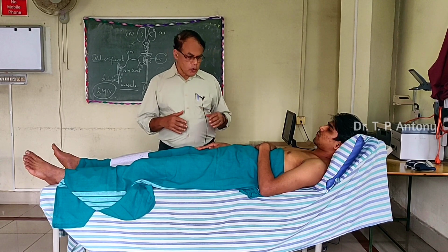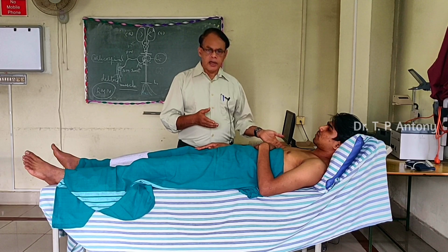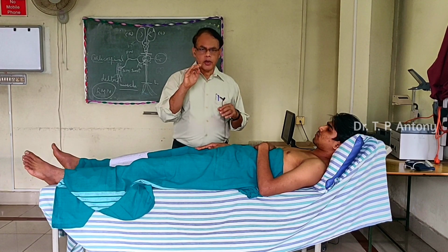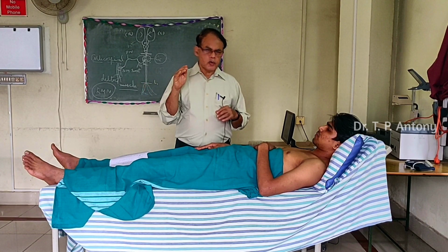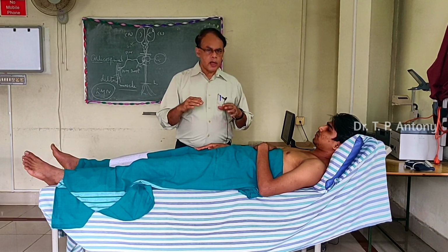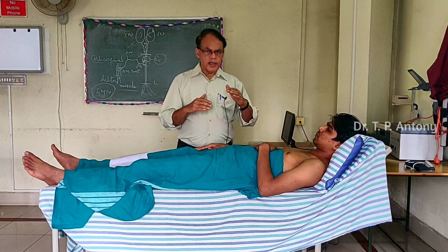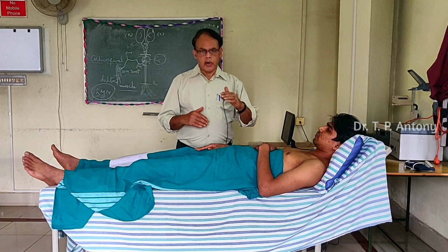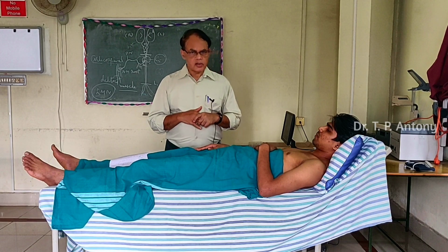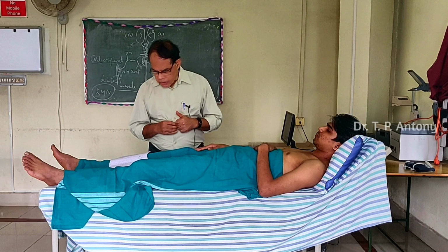When you take the blood pressure with a sphygmomanometer or a mercury manometer, you may find that you are able to hear the Korotkoff sounds corresponding to the high volume pulses alone. As you decrease the mercury column, gradually at one particular point you will start hearing Korotkoff sounds from the low volume pulse also. In other words, when you lower the mercury column, suddenly the Korotkoff sounds double, and this is what is called pulsus alternans, and that indicates the patient is in left heart failure, left ventricular failure.